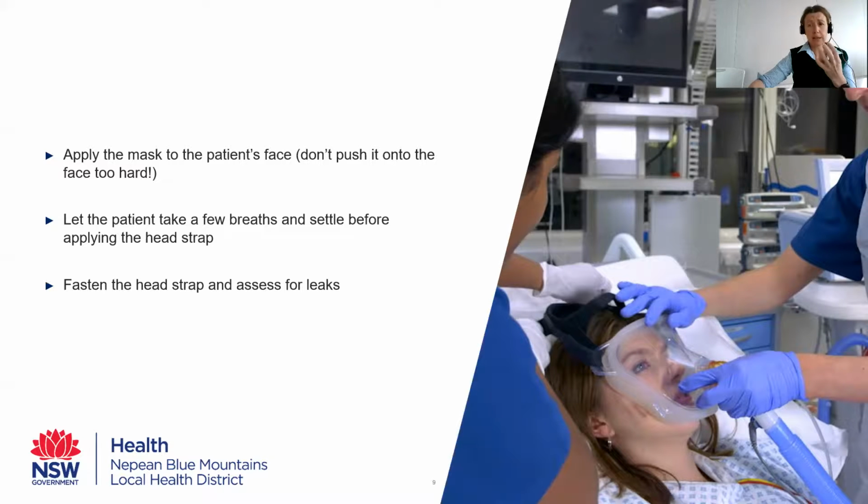We're putting this hard plastic mask over their face, and with you just holding the mask there, it gives them the reassurance that they can very quickly remove it or pull it away if it gets overwhelming or too much. Whereas if you've already strapped it on with the head straps, it's very tight, it's all confining. Patients can panic, they don't like the feel of it, they just want it off.